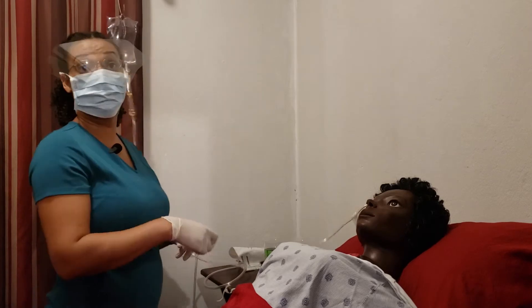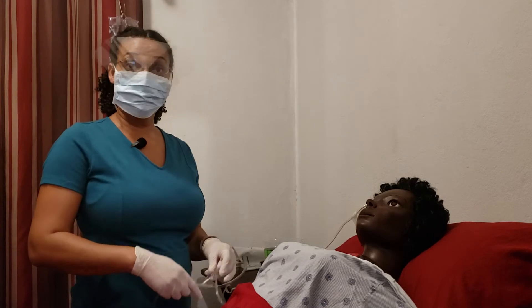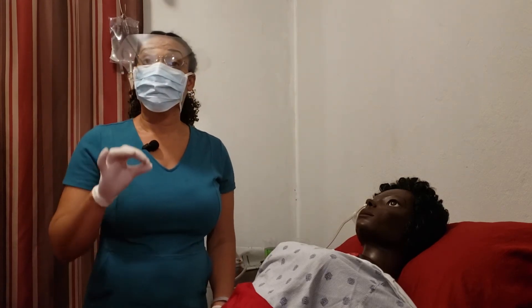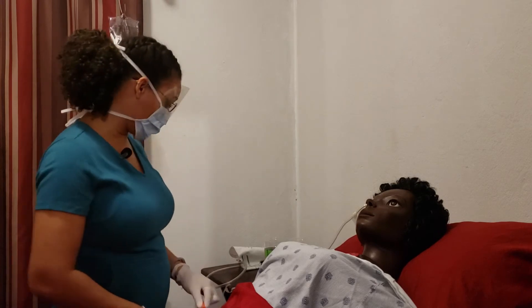You attach your warm solution and let it run through about 50 to 200 cc's. Let it fill the stomach just a little bit. Your stomach can hold up to 1000 cc's of fluid, so putting in 200 cc's is no problem. Once you've got that run through, you clamp it off and then you allow it to drain.